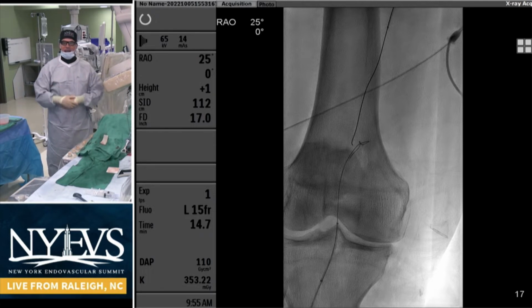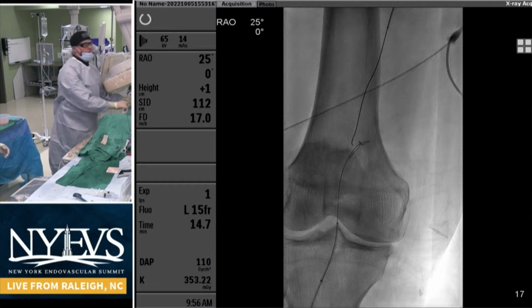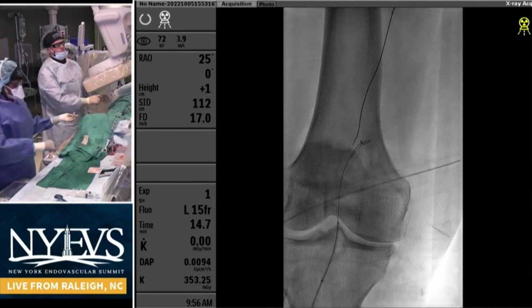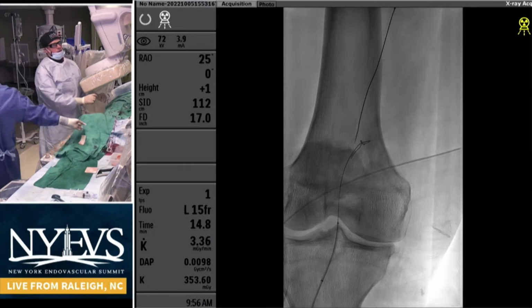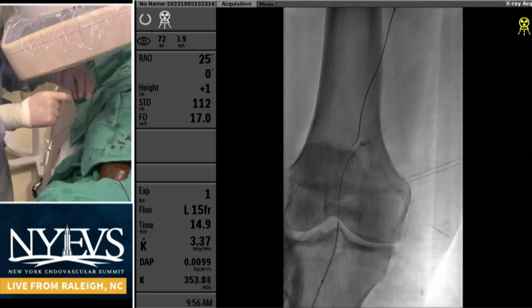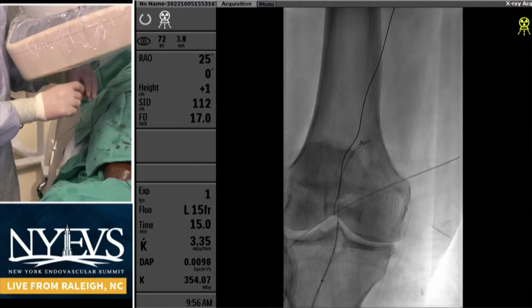Wow. Any comments right now? All right, yeah, so we have a very nice panel of surgeons, IR, and interventional cardiologists. And before the surgeons jump up and say, hey, why is this patient not a candidate for surgery, with good distal targets, we'll just go around to the panel and see what their thought process is, their approach. Antegrade, we just continue the same thought process from last case, but anybody would go antegrade first rather than directly going retrograde. Good visualization, good collaterals, good distal.